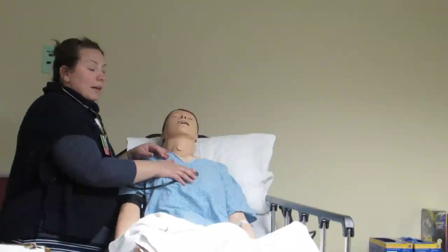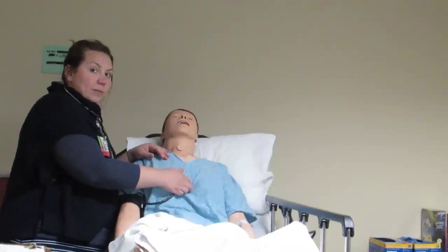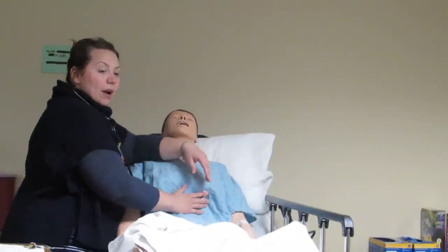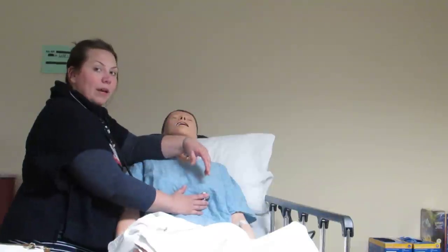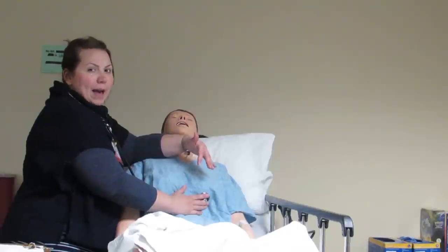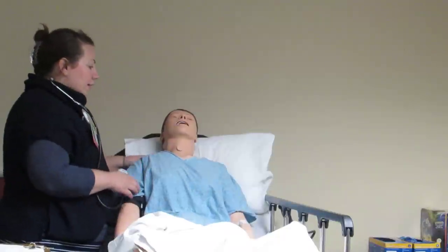I'm going to go down and listen to the heart. So I'm going to count down to the 5th intercostal space. I'm going to move over mid-clavicular, put my stethoscope there, and count the apical pulse for 1 full minute. I'm assessing, is it regular, is it irregular, and do I note any extra abnormalities while I'm listening. Okay, Mrs. Smith, your heart and lungs sound really good.